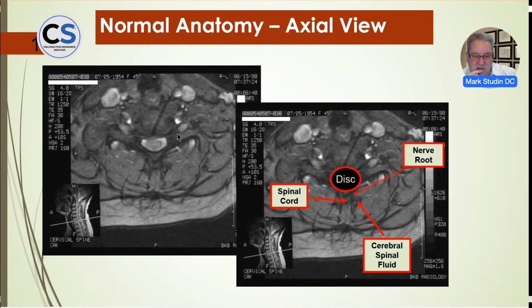Now, it's an educational standard in every state in the United States and every country in the world to need a minimum of 2 views. So you've got to have both views to conclude an accurate diagnosis. And that holds true for any image, with the exception of bone scans. And we're not going to talk about bone scans today. That's a topic for a different day. But bone scans are really important when you're looking for fracture, tumors, degeneration. But MRI is best for visualizing spine. Not X-ray, not CAT scan, MRI.